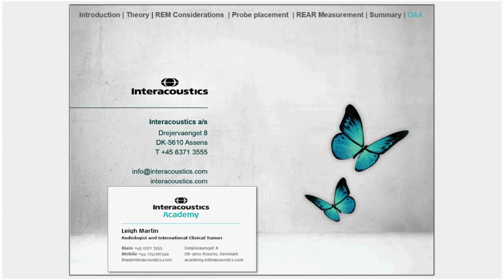But with that in mind, let's see if we can answer these questions. And please do write any more questions which any of you else have in the instant messaging column, and I'll be more than happy to answer them. So the first question is, will you always use speech stimuli when performing the measurement?